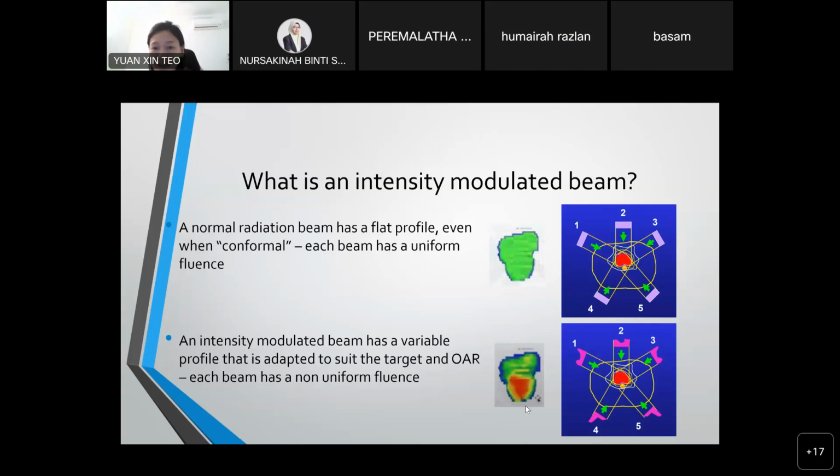But with the IMRT technique, maybe the doctor says, okay, for this prostate area, I want to receive 50 gray, while for the upper part, the lymph node area, I want to receive 40 gray only. So this is why this fluence map will create a hotter dose at this prostate area, while lower dose to these lymph node areas. What are the questions?